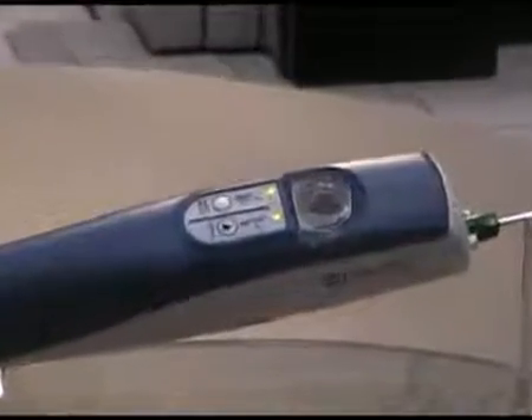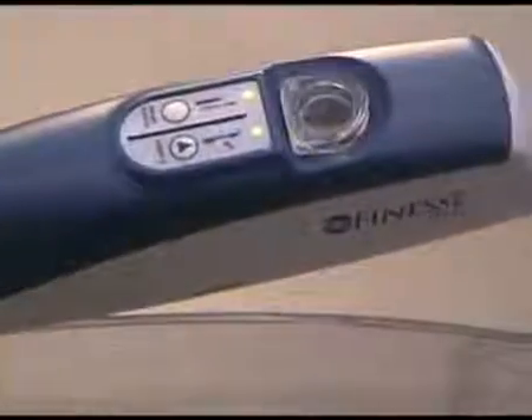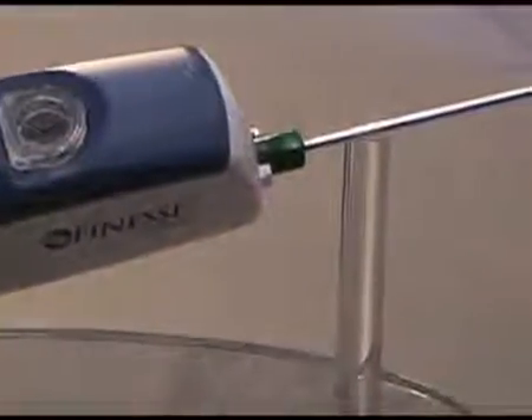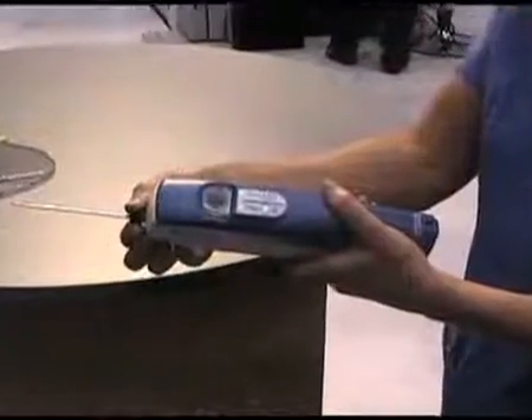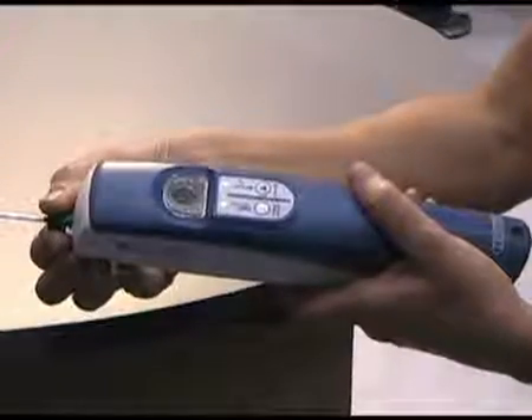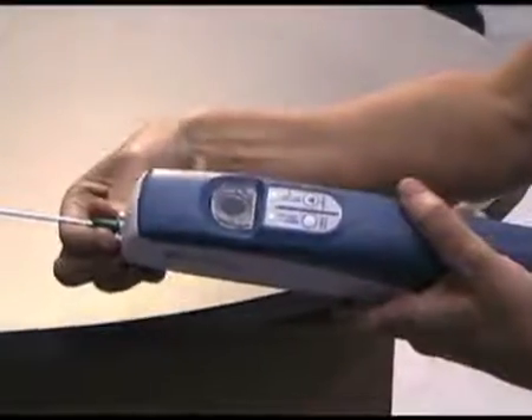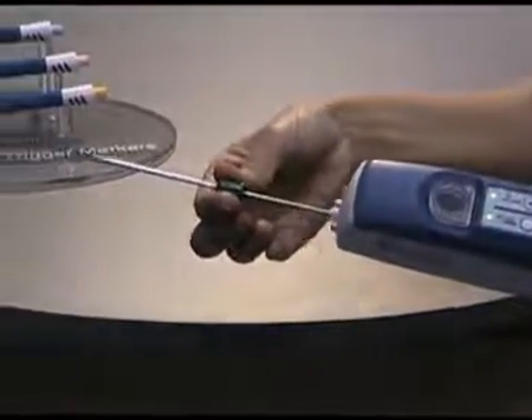It's the only self-contained, vacuum-assisted, ultrasound-guided breast biopsy system featuring SIMS technology. SIMS technology is the ability to acquire multiple samples with a single probe insertion. Finesse has a 10-second cycle time, which allows the acquisition of high-quality contiguous cores through one single probe insertion.